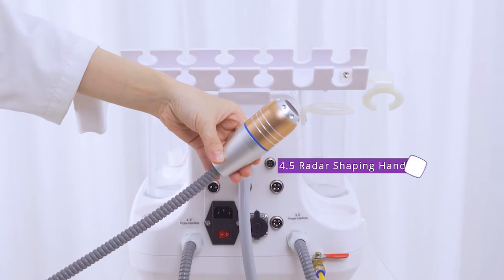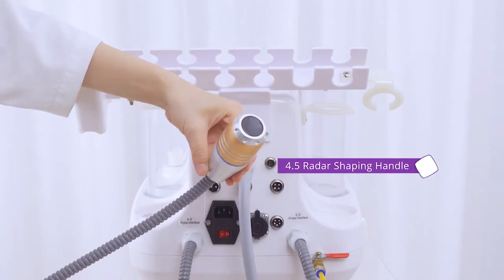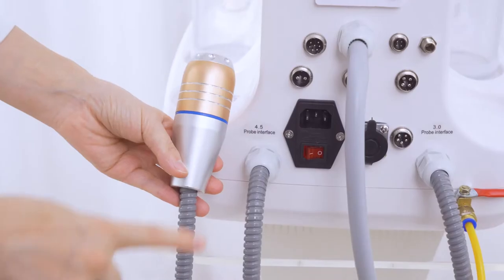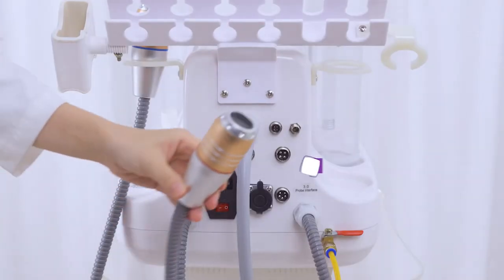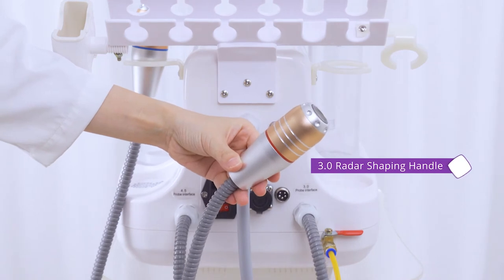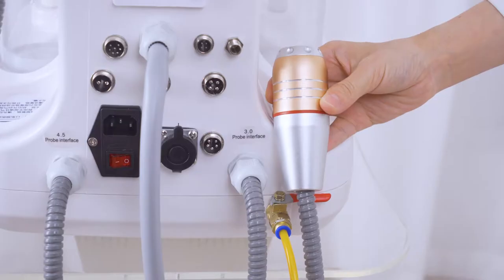Place the 4.5mm radar shaping handle onto the handle holder. Then place the 3.0mm radar shaping handle onto the handle holder.